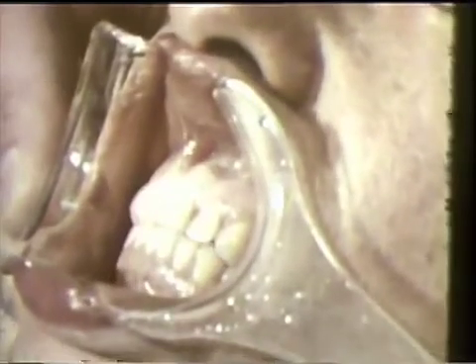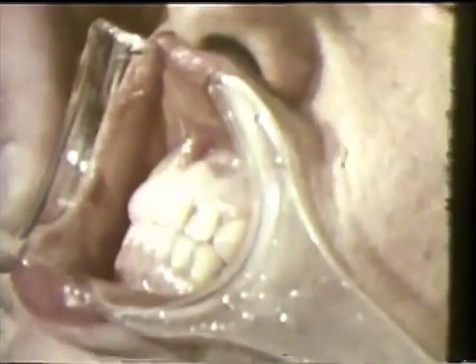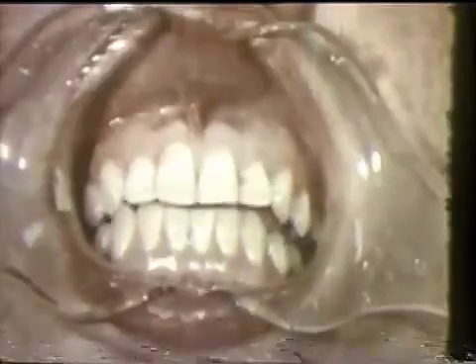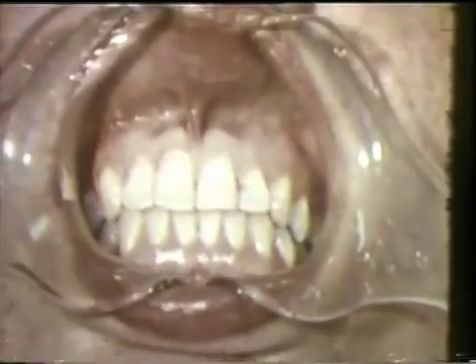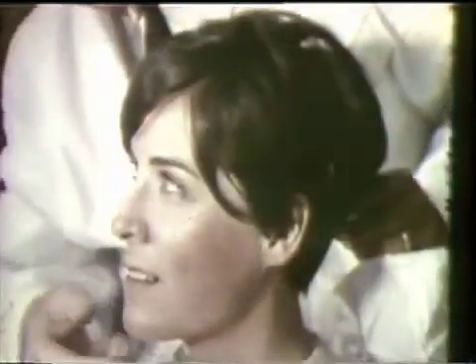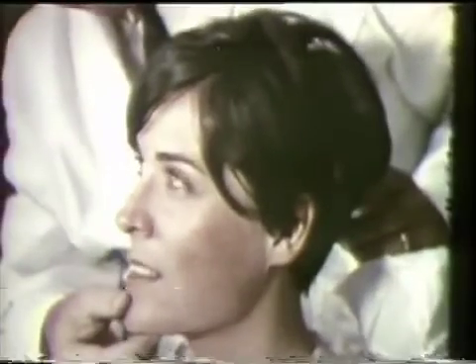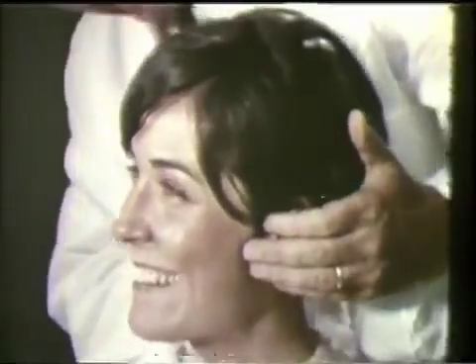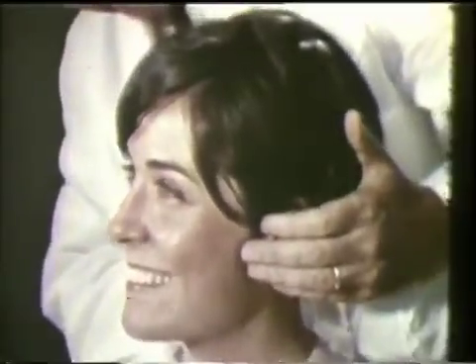She is free of pain and discomfort. Her occlusion has multidirectional, unrestricted, smooth gliding contact patterns. Balancing side interferences have been eliminated and satisfactory incisal and cuspal guidances have been created. The objectives for occlusal adjustment for centric as well as eccentric excursions have been fulfilled.